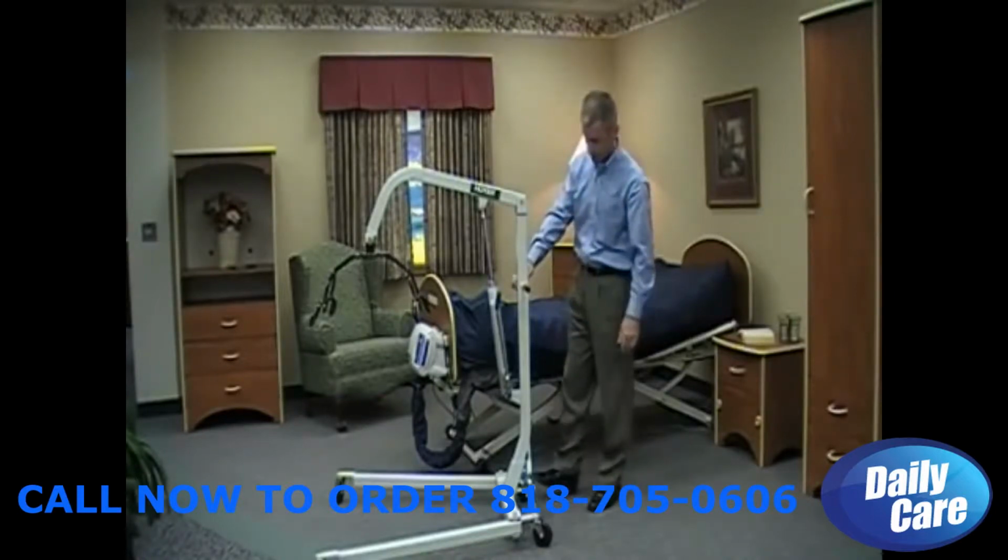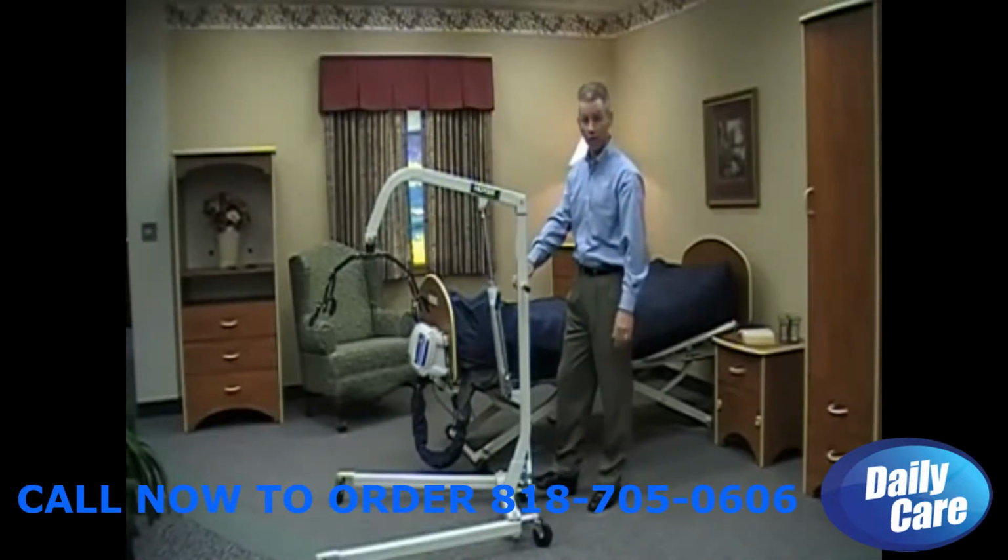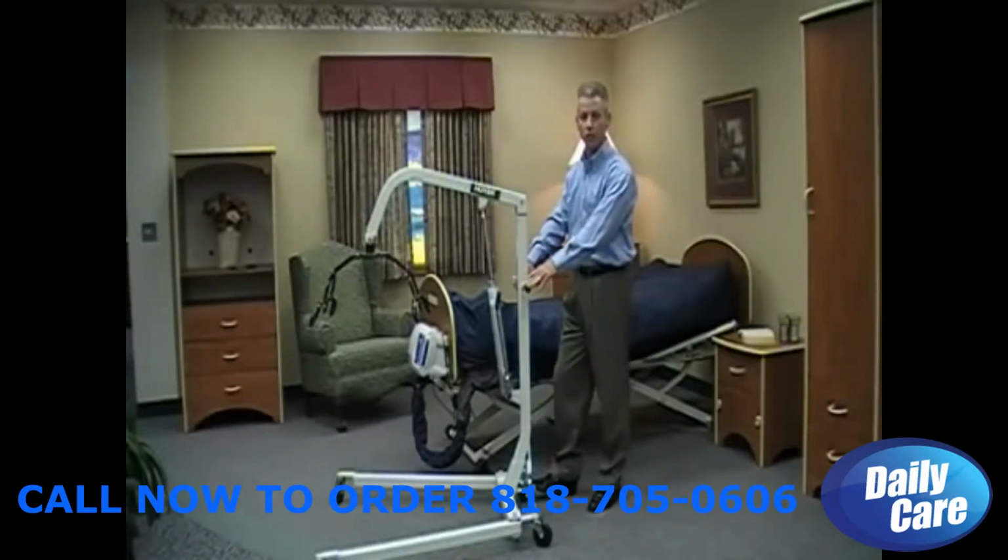And finally, you'll notice there's a wheel lock on the right rear wheel. This is designed for engaging the wheel lock when you're parking the lift when it's not in service. It's not to be used as a brake, but simply as a lock to lock that caster in place once you're done using the lift.